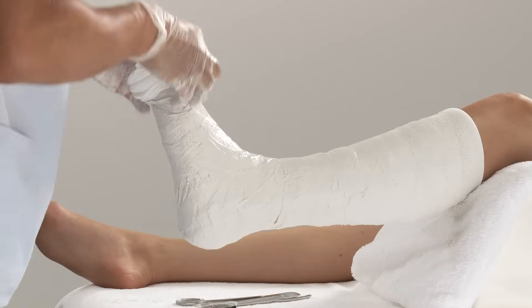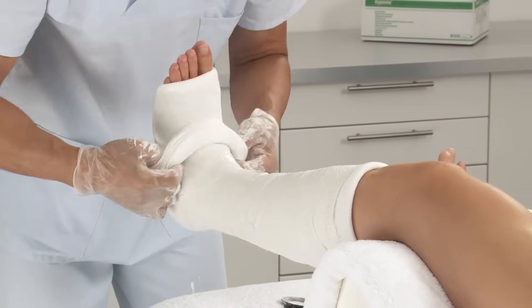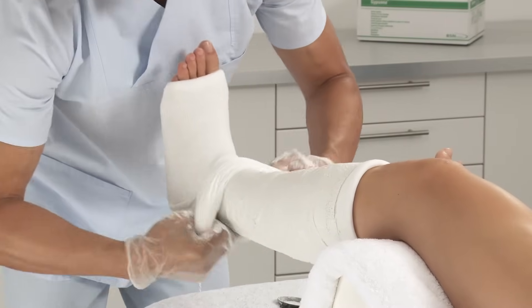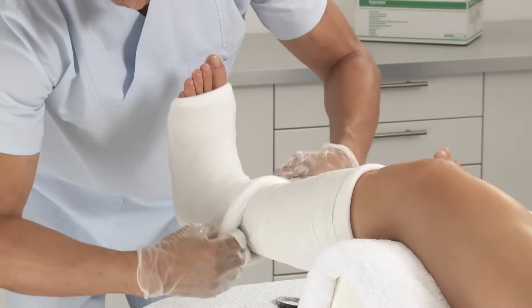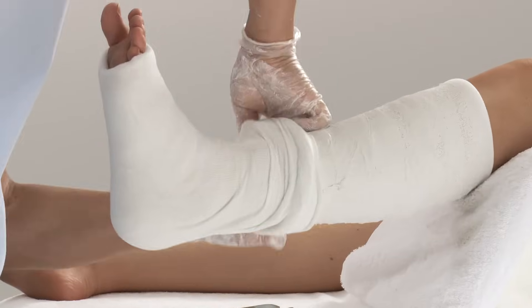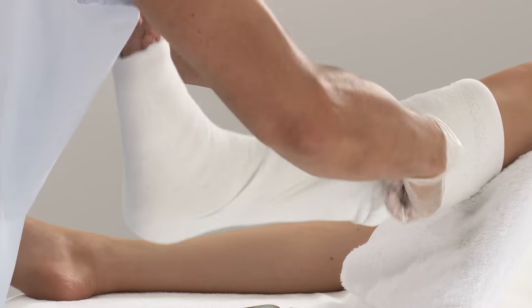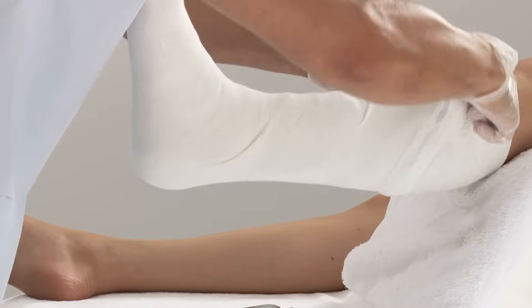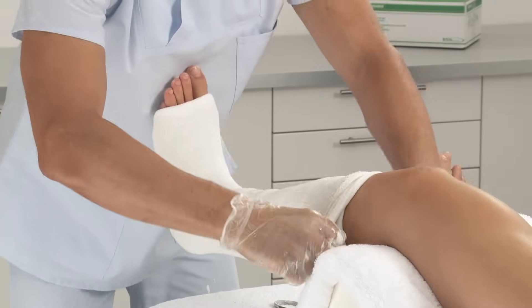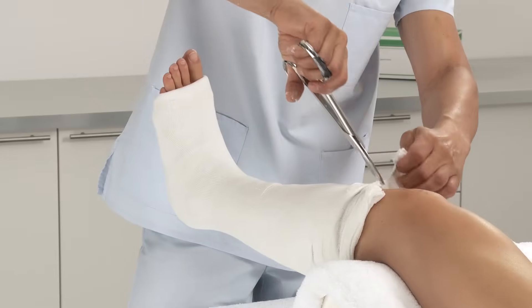Mould and smooth down the cast with the palms of your hands. Fold back the stockinette at the distal end, pulling it up over the full cast and smooth down.